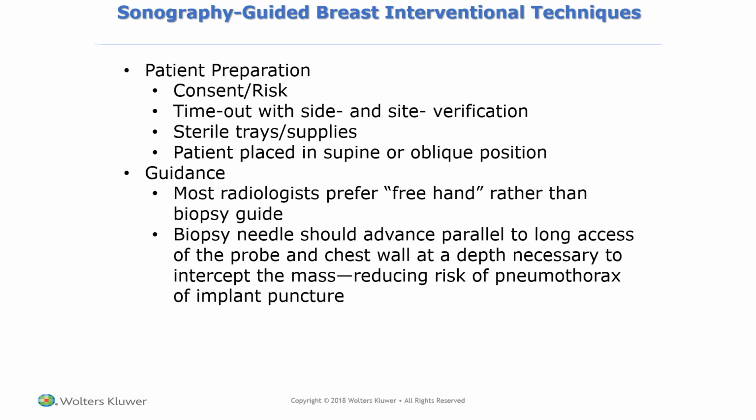So whenever you're doing an interventional technique or procedure, you're going to want to make sure that you as a sonographer are going to be responsible for the patient preparation. So first thing before you do anything with the patient is you want to make sure that you receive their consent. And in order to receive full informed consent, you have to present the procedure to the patient with all the details so they're able to make an educated decision whether they want to proceed or not.